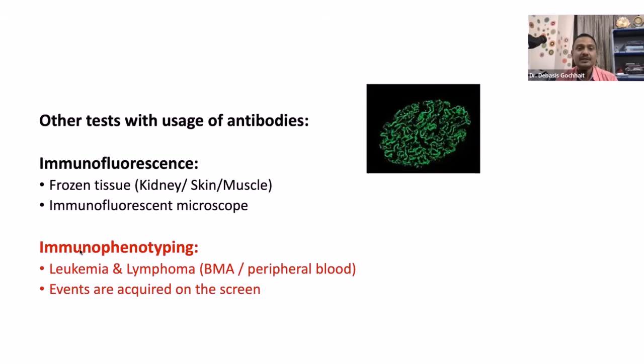Now with immunophenotyping, just like IF and IHC, we cannot see it directly. What we see is the events that were recorded on the screen.